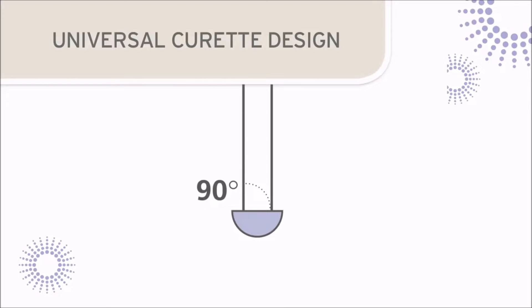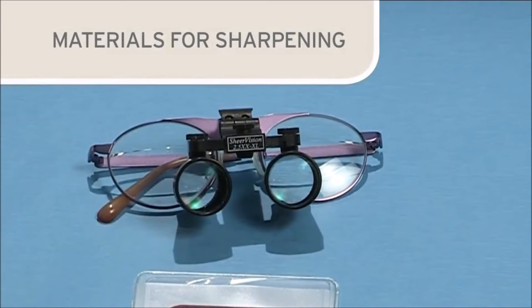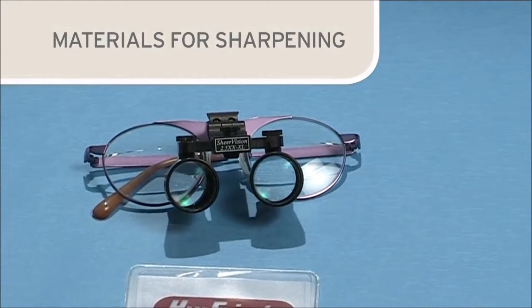When sharpening the Universal Curette, the cutting edges will be restored by grinding the stone against the lateral surfaces of the blade. Before beginning the sharpening process, assemble the required materials.